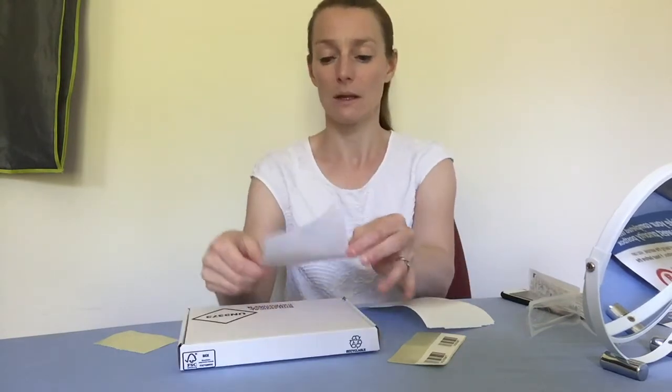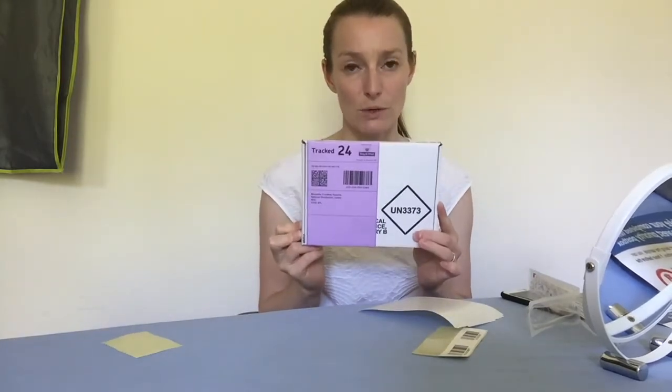You just need to make sure you don't cover this box here. And that then is ready to go in the post box.